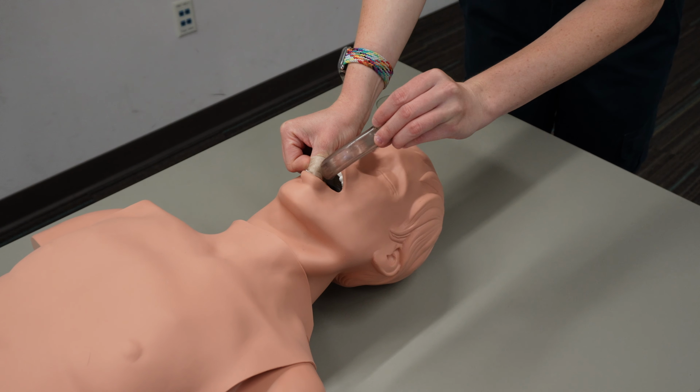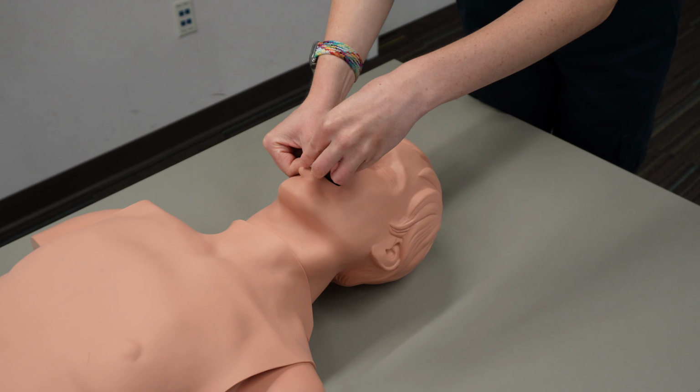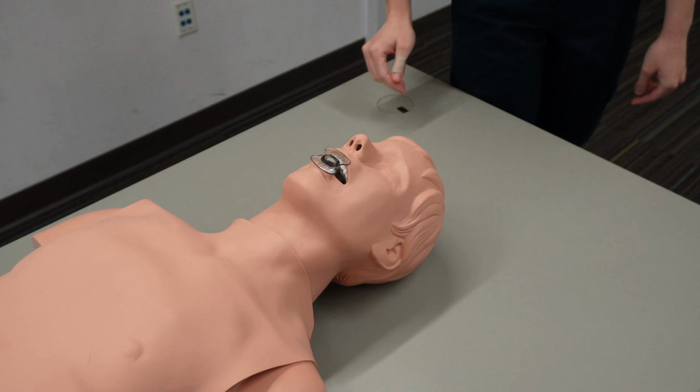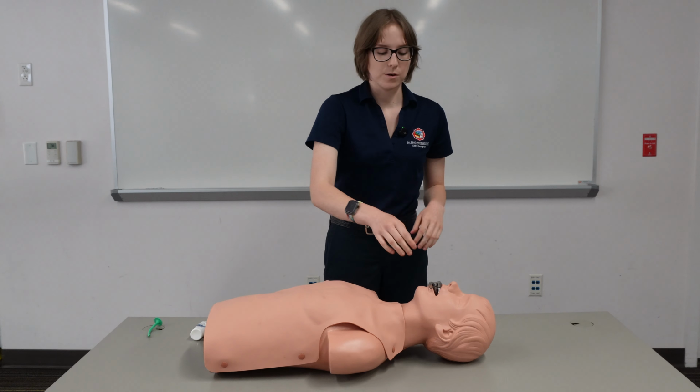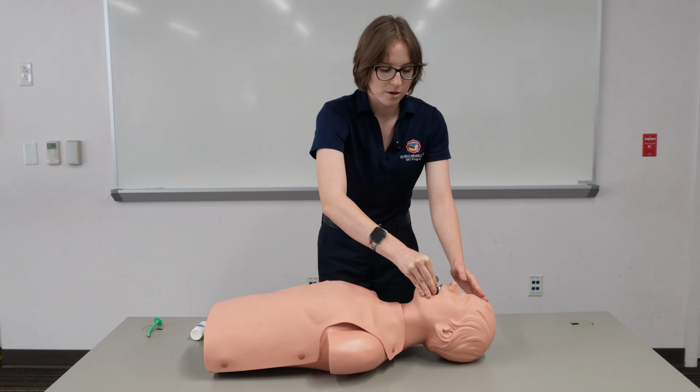I'm going to grab my OPA, inserting it upside down, rotating it 180 degrees when the hard palate becomes the soft palate, making sure that the flange rests on the front of my patient's teeth. If my patient gags when I insert this airway adjunct, I am going to immediately remove it towards the patient's feet.